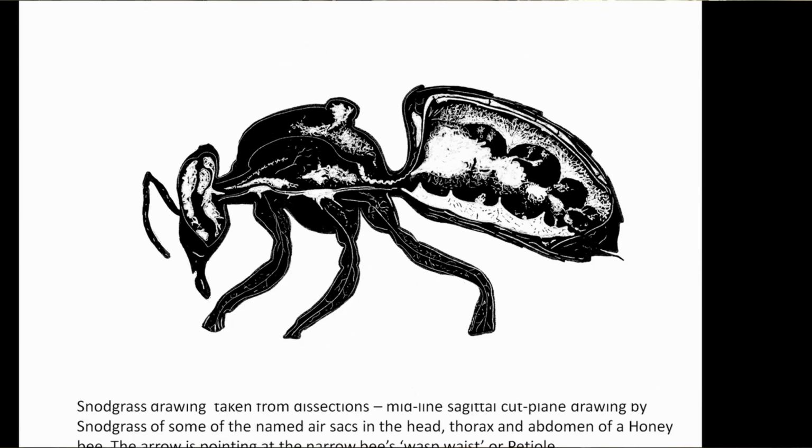The other thing that one does not normally see is the dorsally placed heart and the valves, nor does one see the abdominal aorta. This is because the blood or lymph has a very similar attenuation to the structures surrounding it.